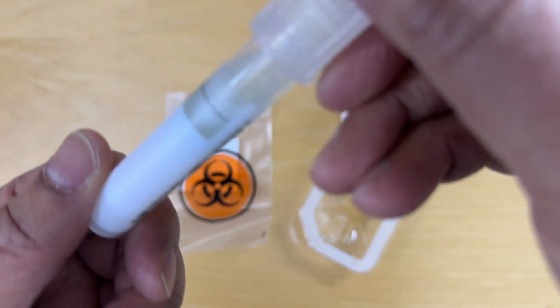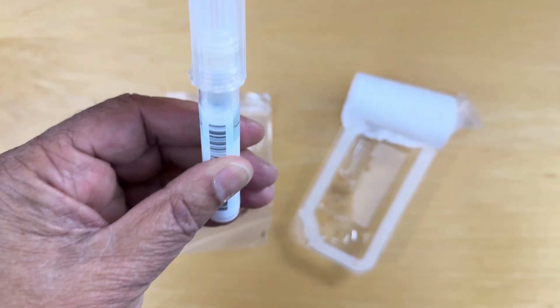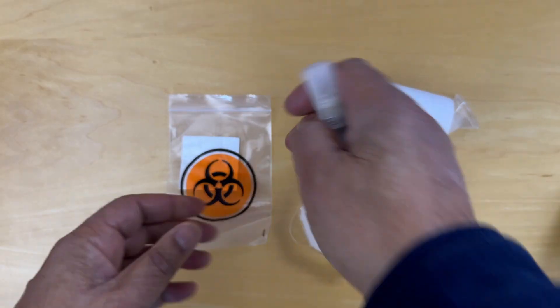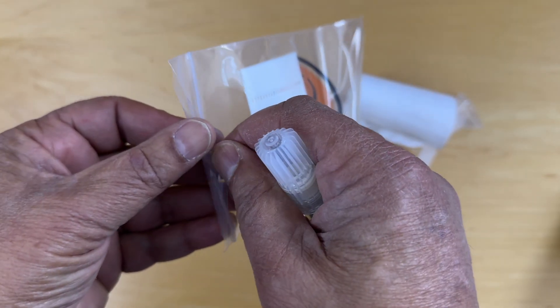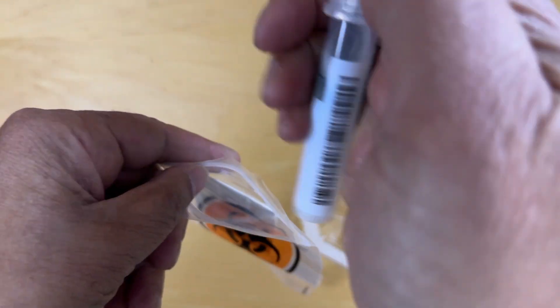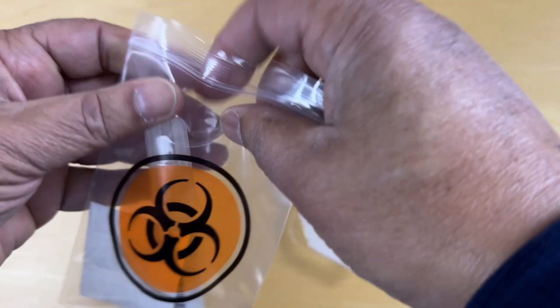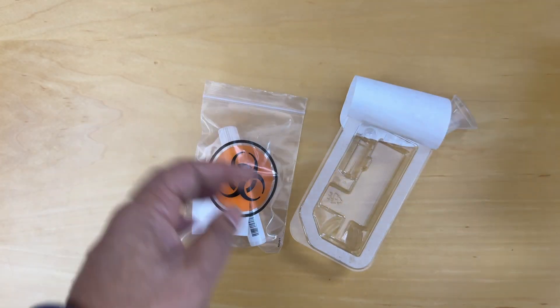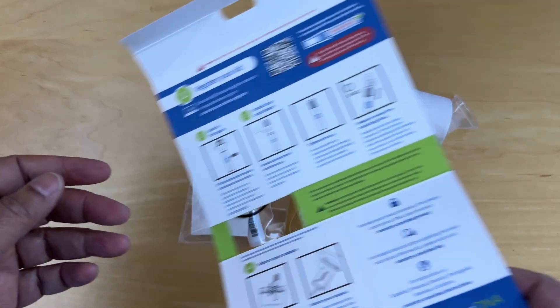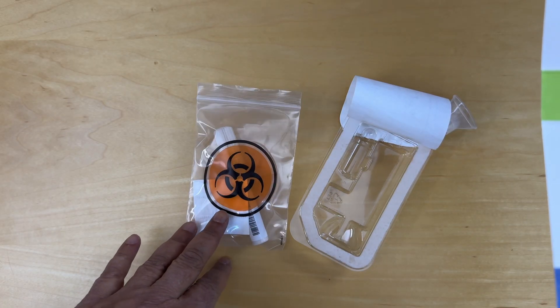That's shaken. When I look at it now, we can see that it's slightly blue-tinted, so this is ready to go. The instructions say to go ahead and insert it into this package here, because it's a biohazard thing. So this is in here — return your sample.